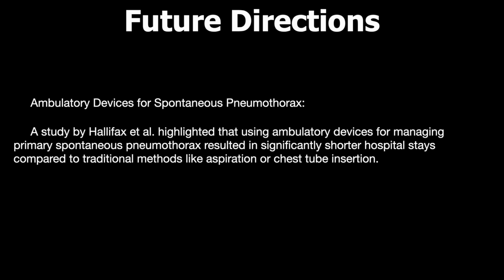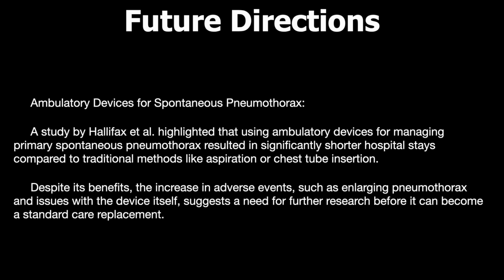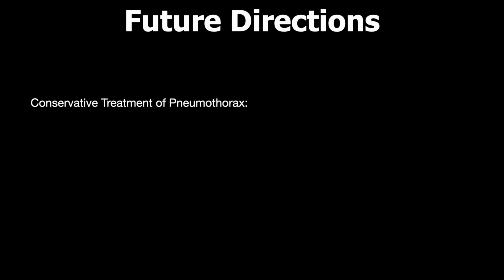Regarding the future direction, ambulatory devices for spontaneous pneumothorax. A study by Halifax et al. highlighted that using an ambulatory device for managing primary spontaneous pneumothorax resulted in significantly shorter hospital stays compared to traditional methods like aspiration or chest tube insertion. Despite this benefit, the increase in adverse effects such as enlarging pneumothorax and issues with the device itself suggested a need for further research before it can become a standard of care.